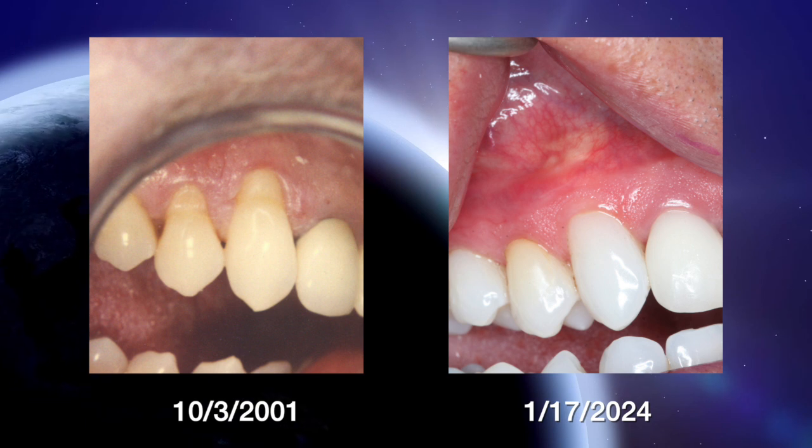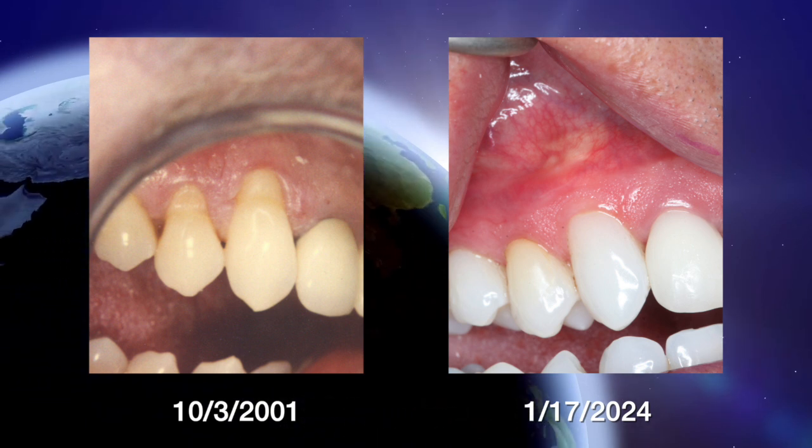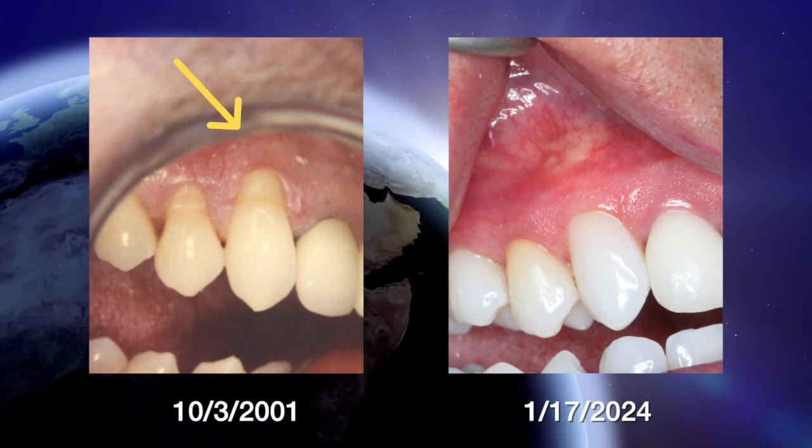We did the Pinhole Surgical Technique at that time, and now this is January 17, 2024 — more than 22 years later. We have this wonderful result here and here.